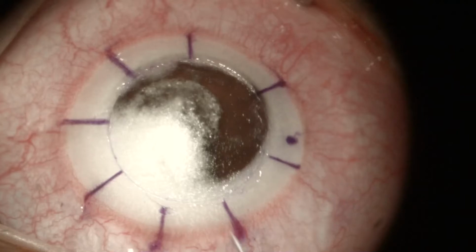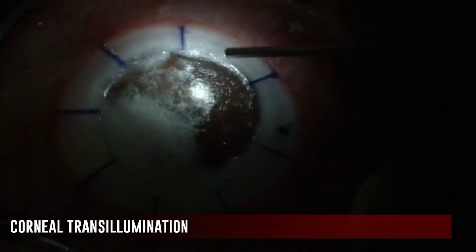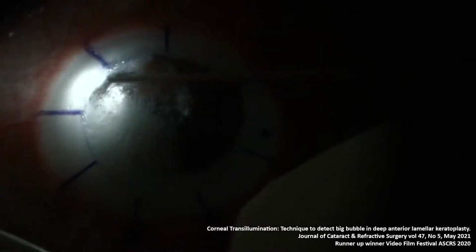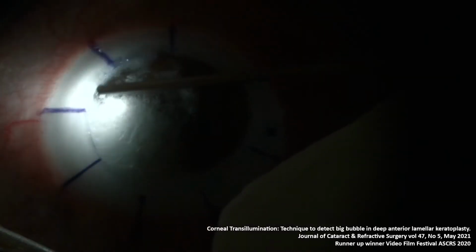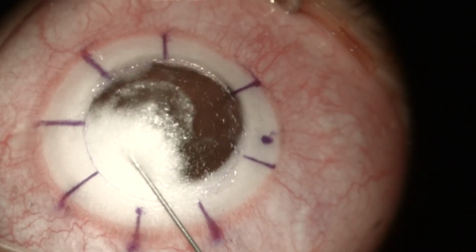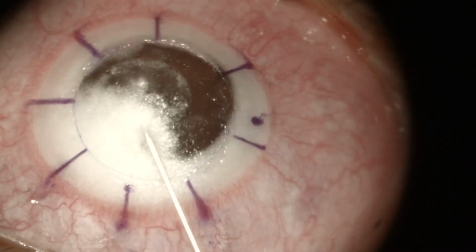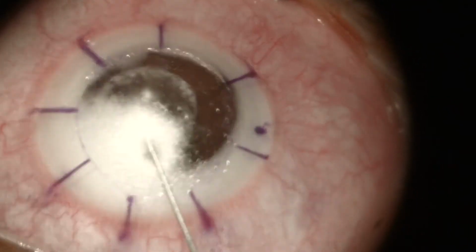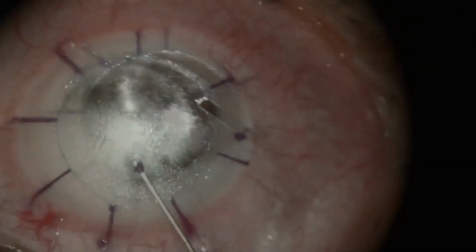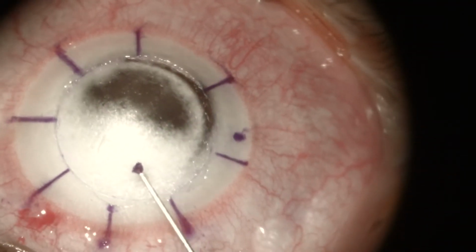We now have a new tool to assess the complete formation of the bubble: the corneal transillumination. This can be easily done with a vitrectomy light probe, as we can see in these images. In this particular case, we were forced to inject air several times in order to achieve the desired size. It is useful to mark the border of the bubble with the aid of the transillumination to inject air from that side without risk of perforating.